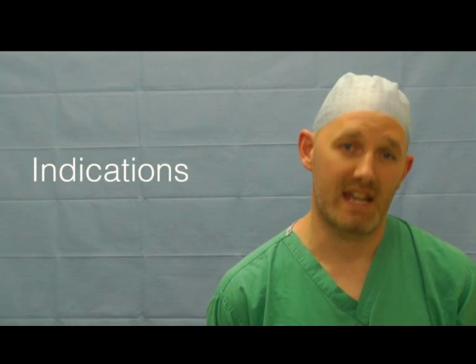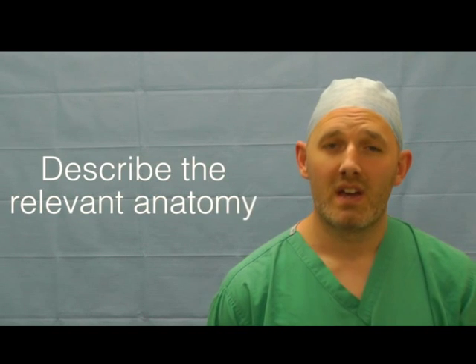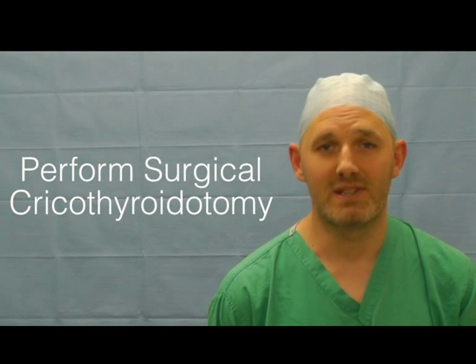So hi there, the aim of this brief video is to demonstrate and teach you the surgical cricothyroidotomy using the scalpel bougie technique. By the end of the video you should be able to describe the indications for the technique, to list the relevant equipment that you'll need, to describe the anatomy, and then finally to perform the surgical cricothyroidotomy using the scalpel bougie technique.